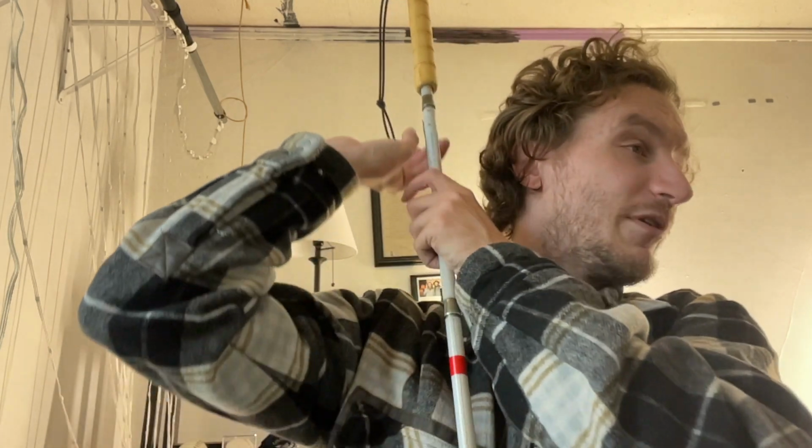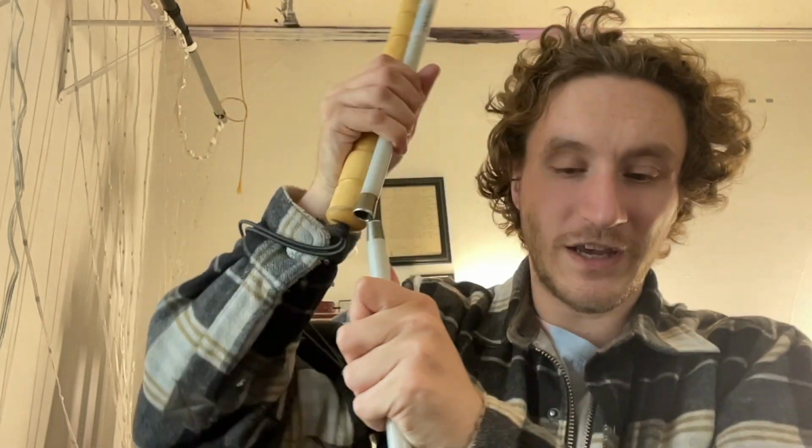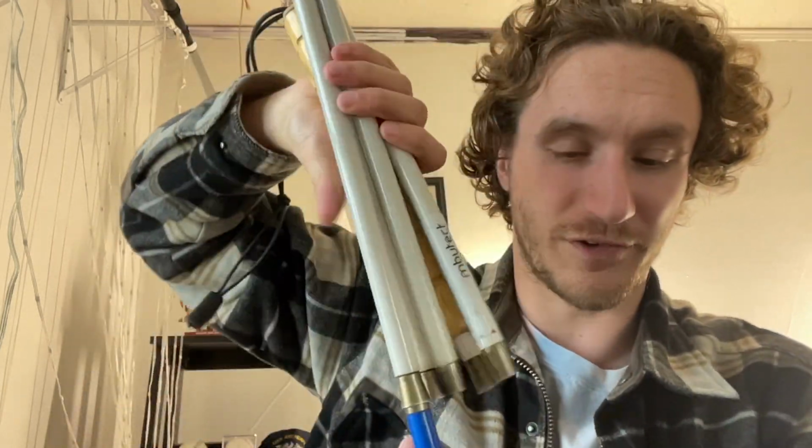The bungee cord, which Ambutech also sells as its own accessory, unlike most cane companies, tends to have to be replaced before the cane itself. So, I'm going to fold up the Ambutech. And like I said, this has been my daily driver for quite a while, and honestly, that was not the goal. I used to always use canes from the National Federation of the Blind, and NFB is the acronym that we use for National Federation of the Blind.